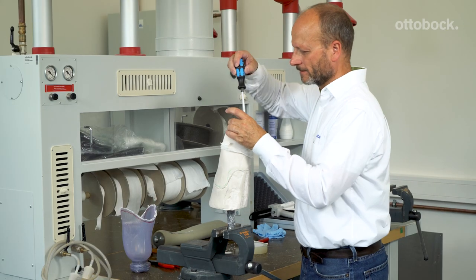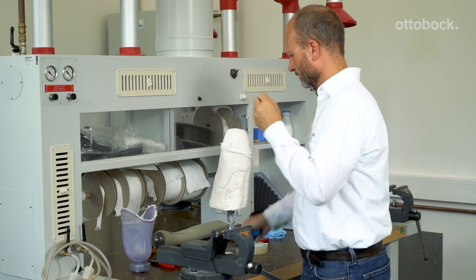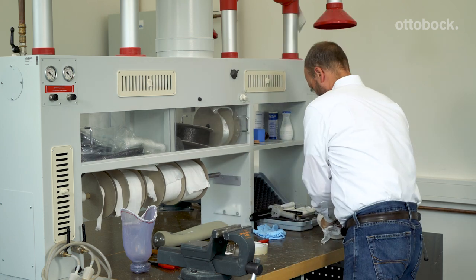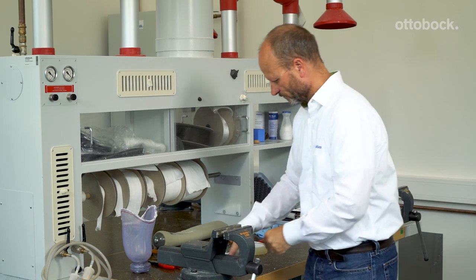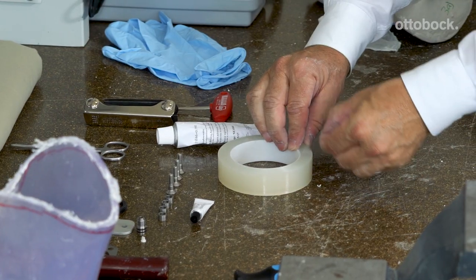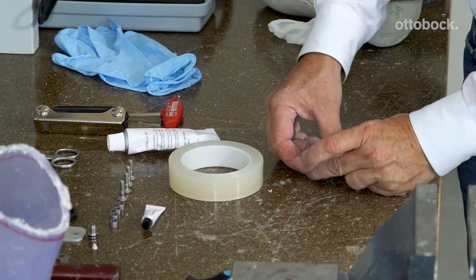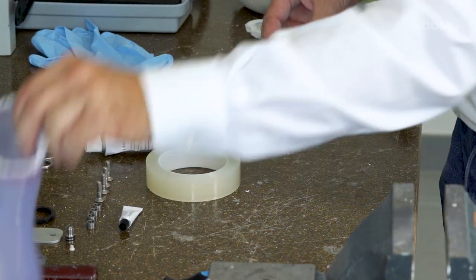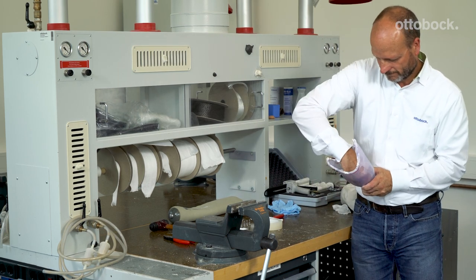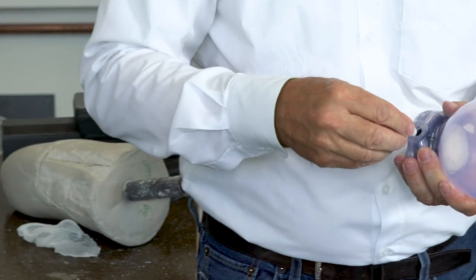Remove the piston dummy from the plaster model. Close the opening in the piston dummy with Plasta band or tape and insert it into the cylinder — this will keep the cylinder clean while sanding the contours of the socket. Screw in the valve dummy.